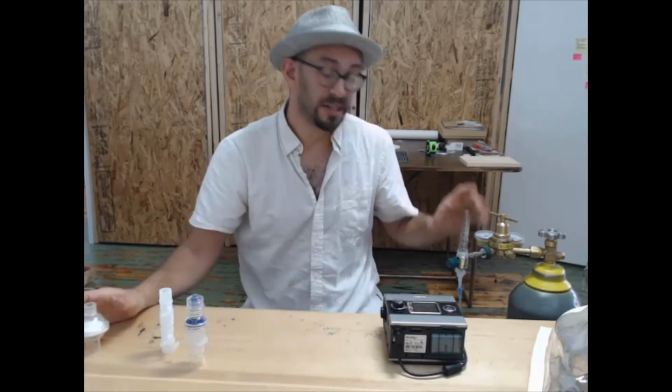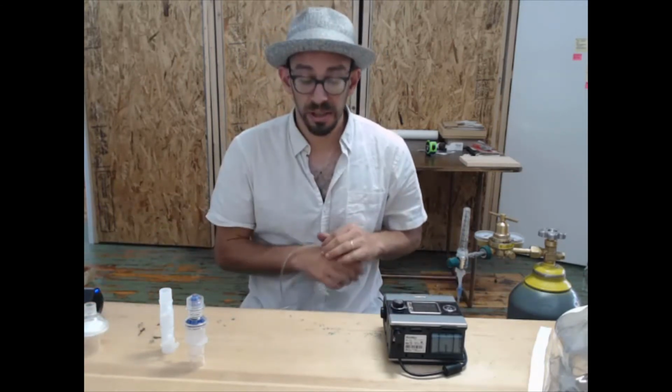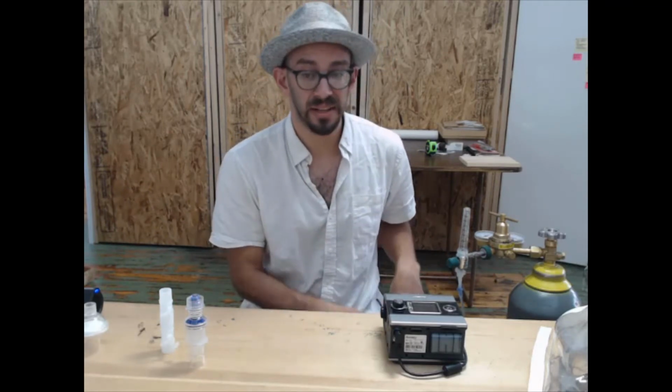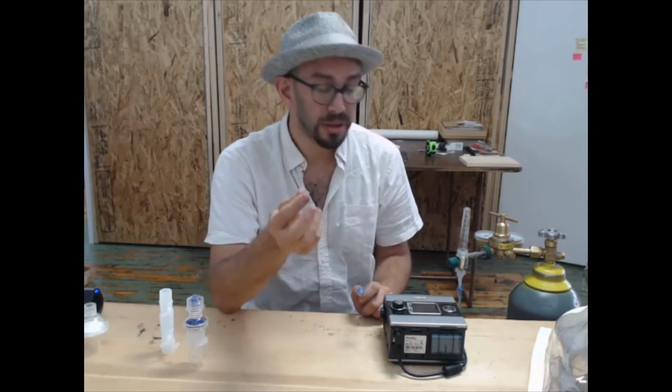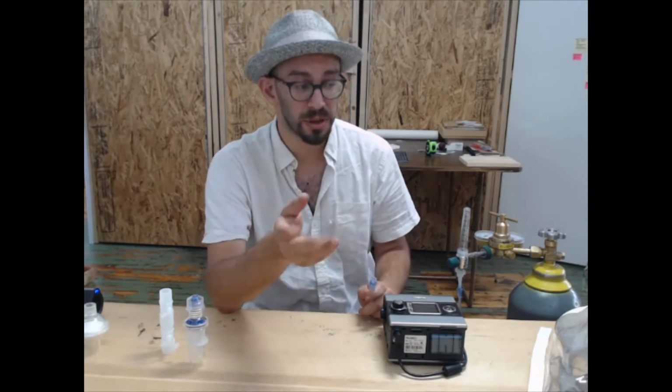The other thing you need is oxygen. These circuits require a relatively high supply of oxygen, up to 35 liters a minute, to deliver high FiO2s. And that is important. Please make sure that you have a supply of oxygen in your hospital.